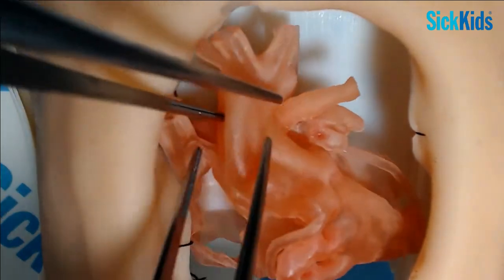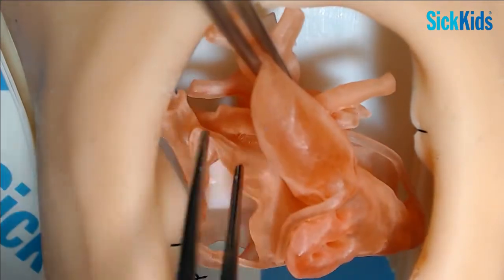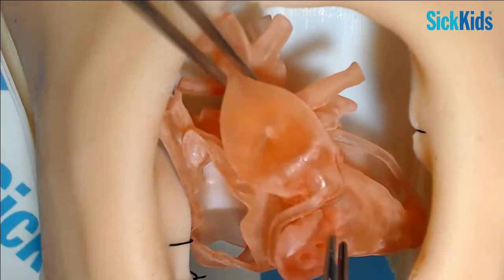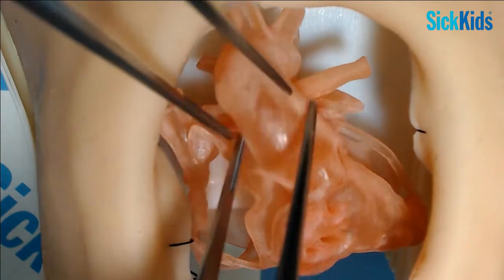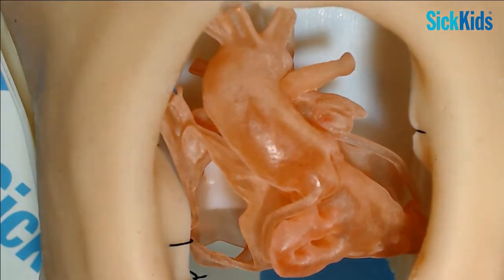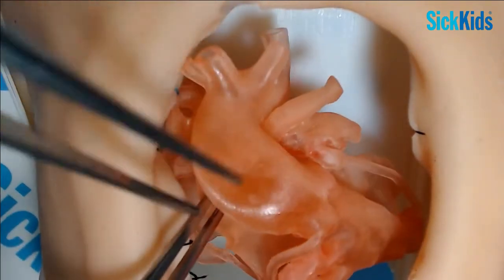And then if we cross clamp here, as you can see there's plenty of room today, and your pulmonary arteries are snared, so you give your plegia into the root and there's nowhere else it can go, hopefully, but down the coronary arteries, as long as your truncal valve is okay. So you cross clamp and the first thing is going to be mobilising your pulmonary arteries. What we'll do is take them off on a button, and you've got two choices. Some people just transect the trunk completely and then take the pulmonary arteries out on a button, which is perfectly legitimate.